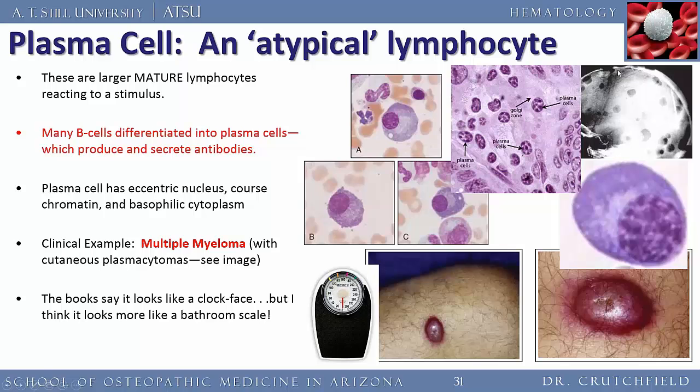And then here is a patient who has multiple myeloma. It turns out that it causes bone to be eaten away. You take an X-ray of the skull, and they have these areas in the skull which are literally eaten away by these crazy plasma cells. I've seen patients with multiple myeloma, but I've never seen a biopsy of the skull lesion. But I suspect these are probably also plasmacytomas. They're just in the skull.